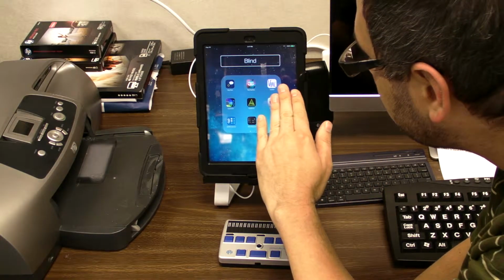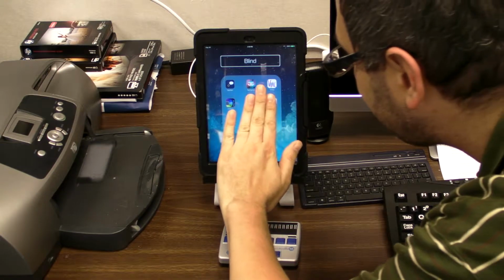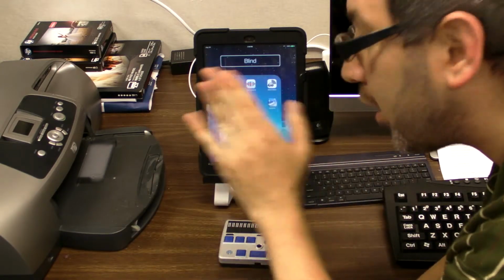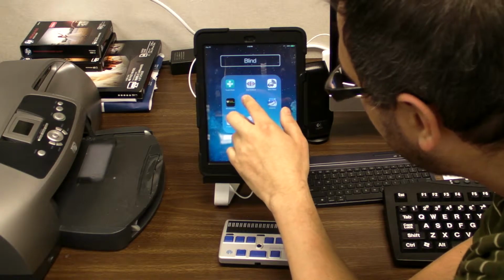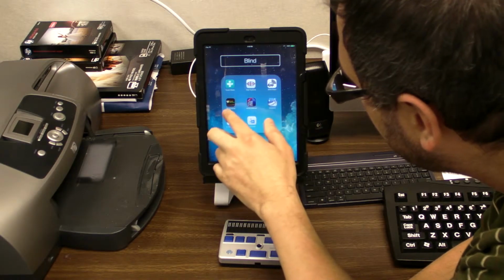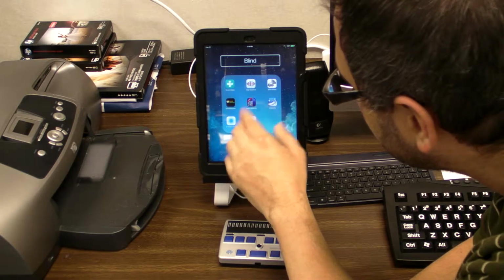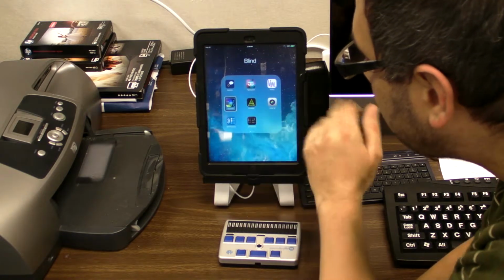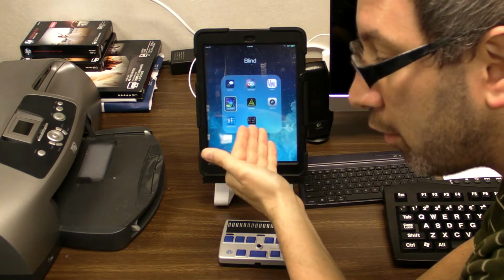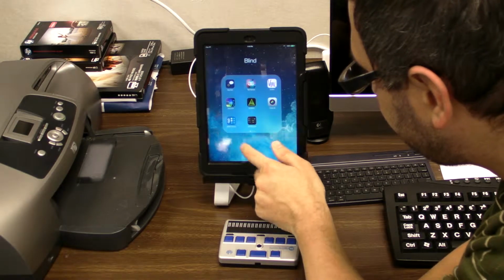Now to scroll to another page, to scroll left, right, or up or down, it's 3 fingers, slide in the direction you want to move the screen. 3 fingers, very important. Finger gestures. Tune In Radio, Digit-Eyes, Light Detector, Eye Blink Radio, Blind Bargains, Audio Labels, Voice Eye, Flexi, Translate, and Audible. Those are really popular apps which cater to people who are blind. Page 1 of 3, Page 2 of 3, Page 3 of 3.